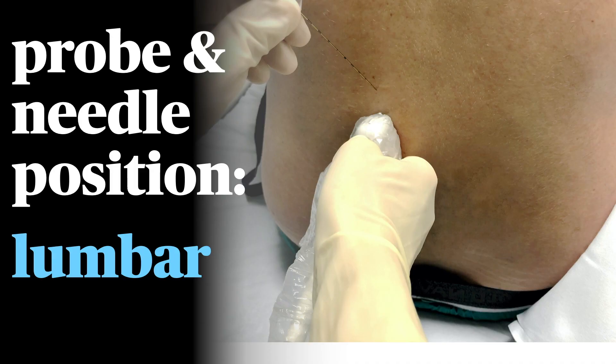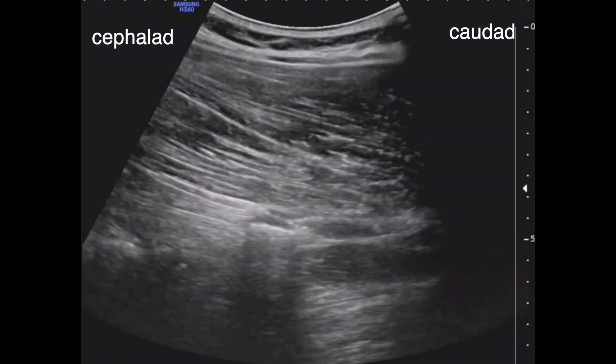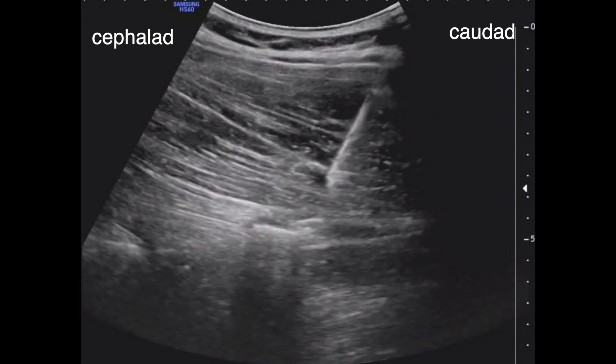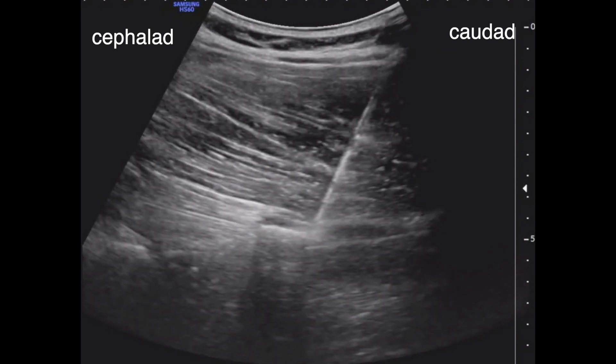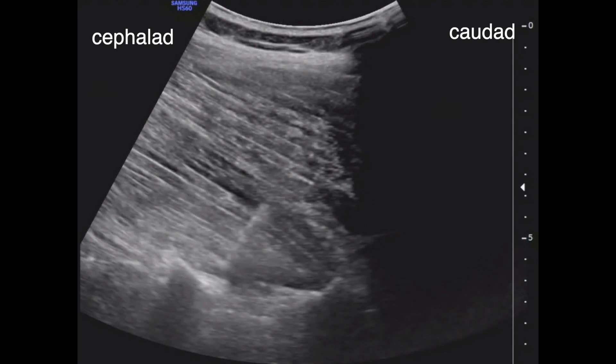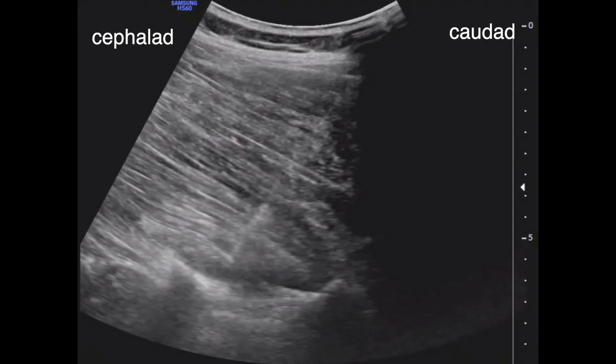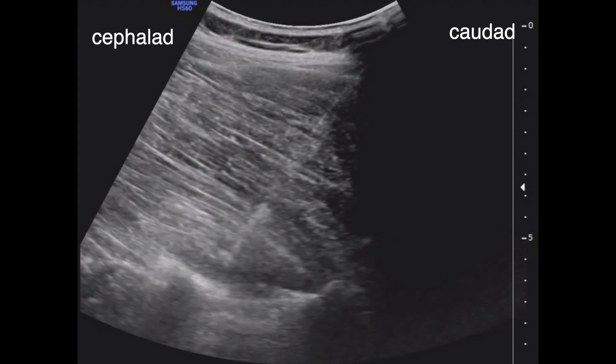For lumbar indications, we usually do the blocks at L3 or L2. Imaging L4 and L5 can be challenging due to the depth, and since the local spreads two-plus levels down and up, it covers most indications. Here we see the much thicker ES muscle overlying the L3 transverse process. A needle is advanced in-plane in order to contact the bone, and small test injections confirm that the local is spreading immediately superficial to the bone and underneath the muscle, at which point the local anesthetic is administered.